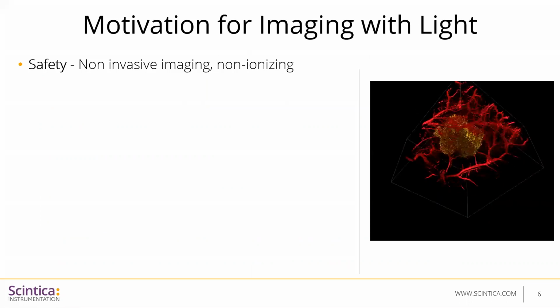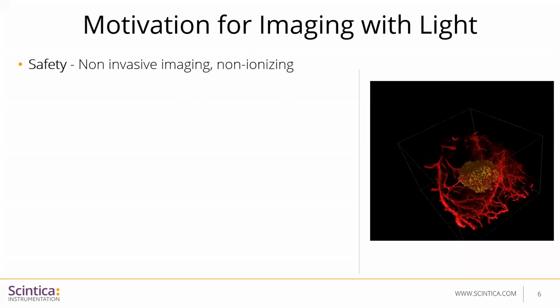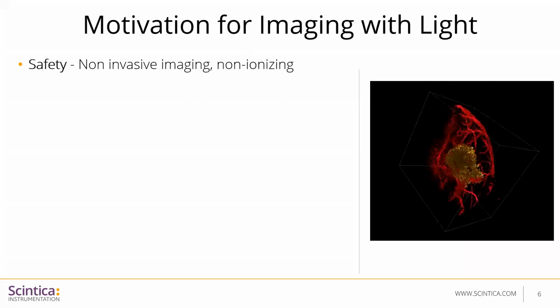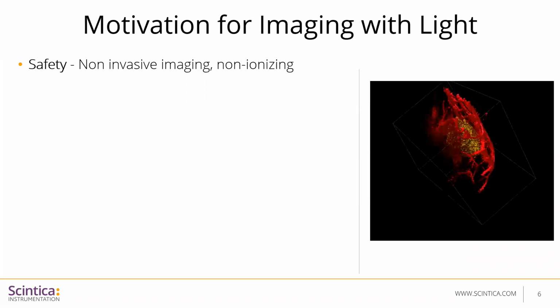So what is the motivation for imaging with light? The first and foremost thing is safety. This imaging modality uses non-invasive imaging and non-ionizing radiation. The light that is used is in the visible range and does not harm or have any ionizing effect.